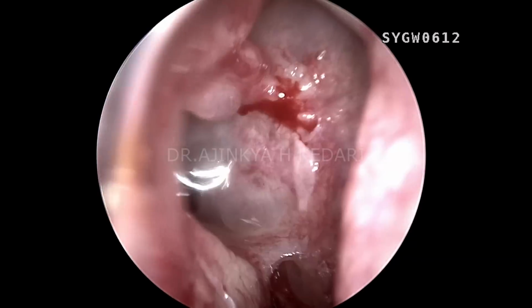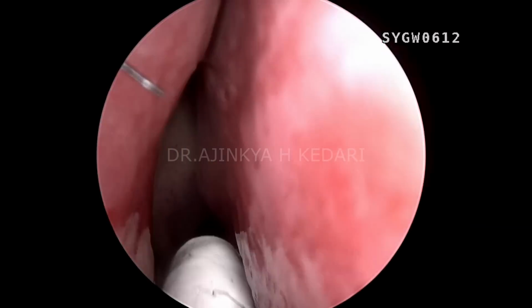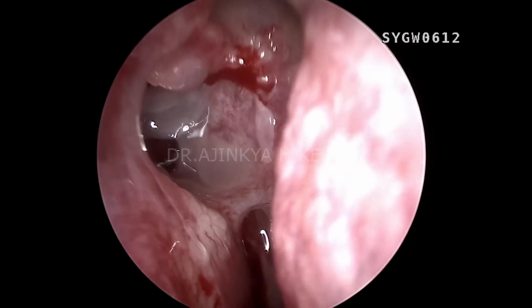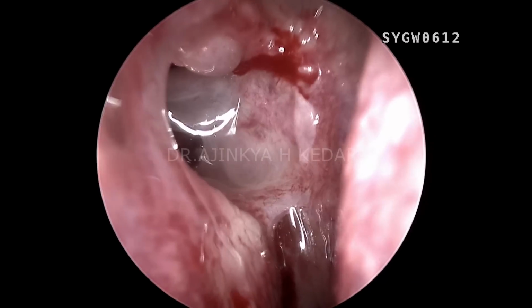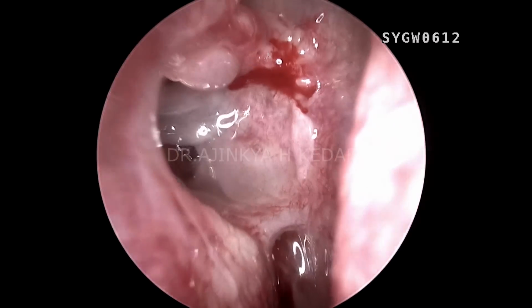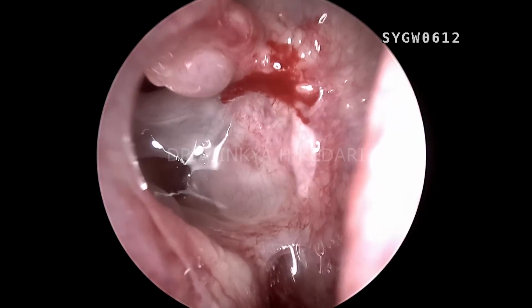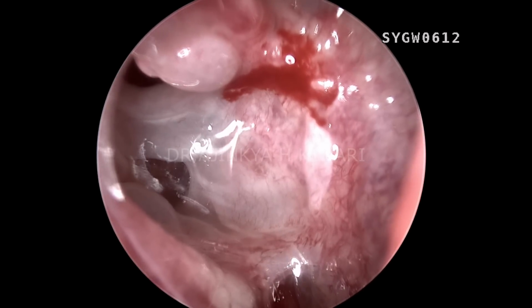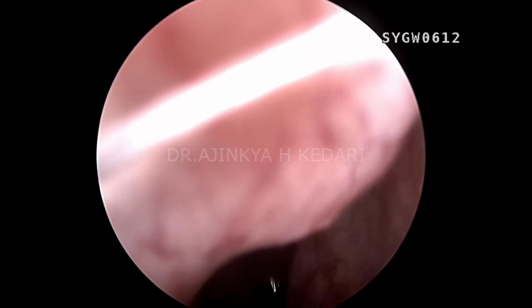So what you can see, that's the CSF leak that is happening right there. After decongestion, what I can see directly head on is the middle turbinate along the septum, and what you can see right there is a clear fluid with pulsations, and you can see it is actually pouring out. And at your 12 o'clock, a lot of granular tissue, granulation tissue basically.